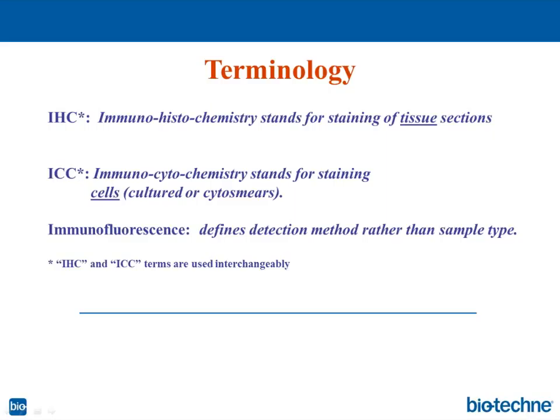Quite often these terms are used interchangeably, but we will delineate them, because not all techniques for multicolor fluorescence can be used on both tissue sections and cells.